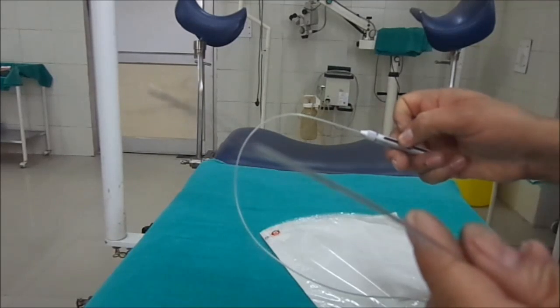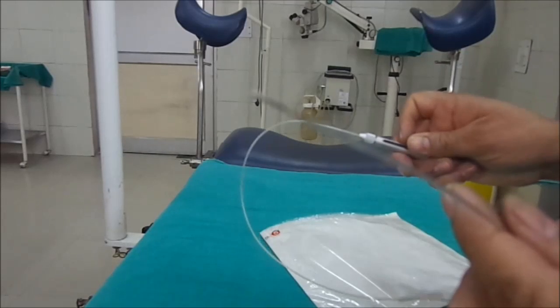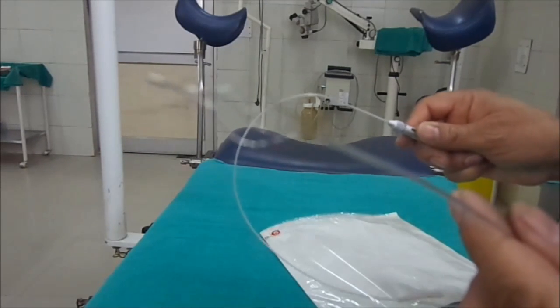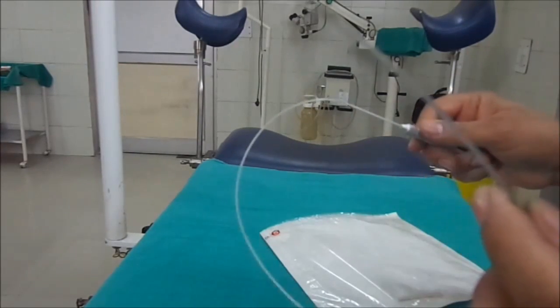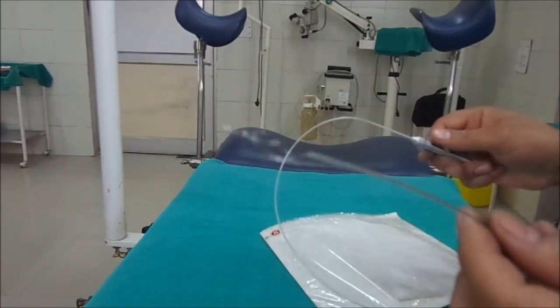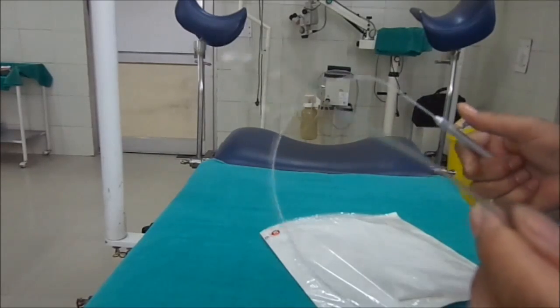What we do is come in contact with the stone, open the basket to take the stone inside it, then make it tight to get the stone extracted through the sheath of the cystoscope. While introducing it into the cystoscope, it is closed — making it look just like a simple wire.